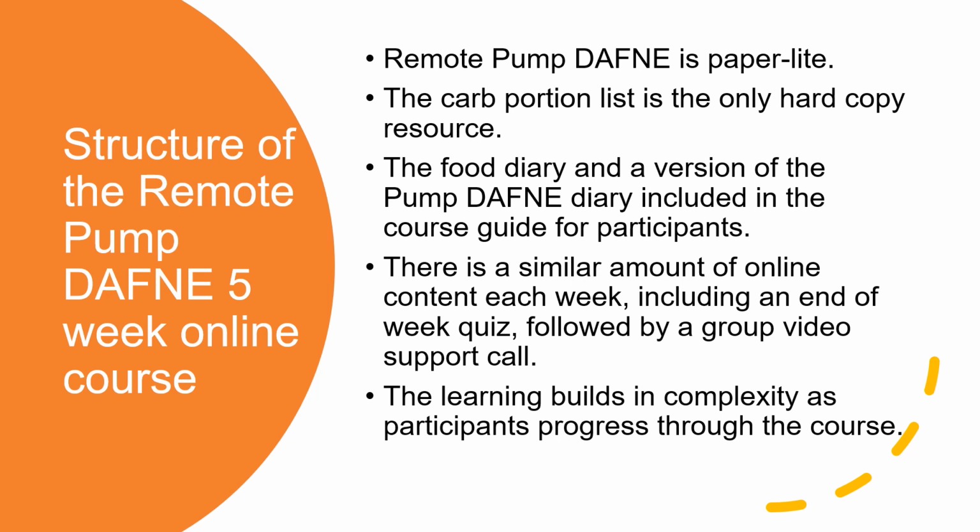Weekly group video support calls are structured in a similar way to the remote DAFNE course. The suggested timing for calls allows time to cover the content and to discuss pump settings, where to find them and how to adjust them. The learning builds in complexity through the weeks, encouraging participants to use pump functions. Participants continue to have access to the online course for reference and to refresh their knowledge after they have completed the course.